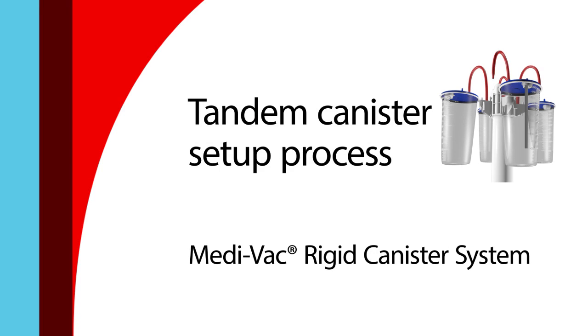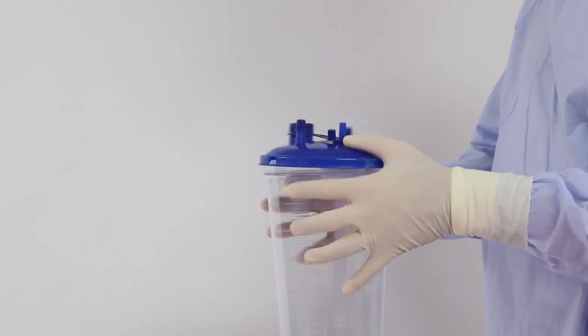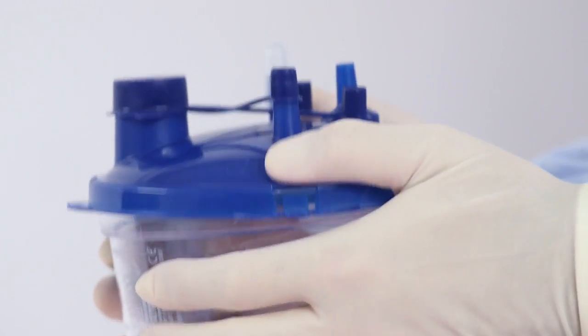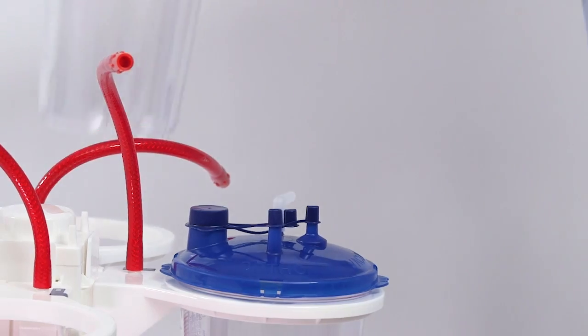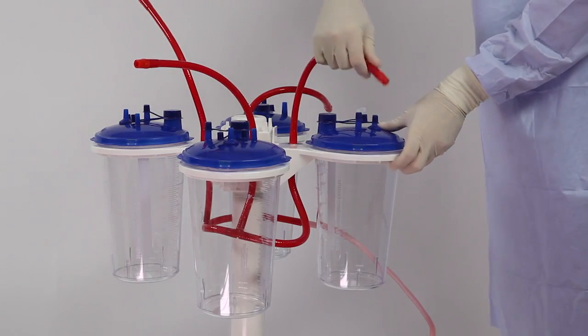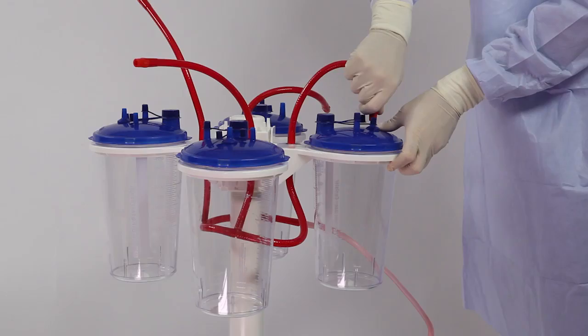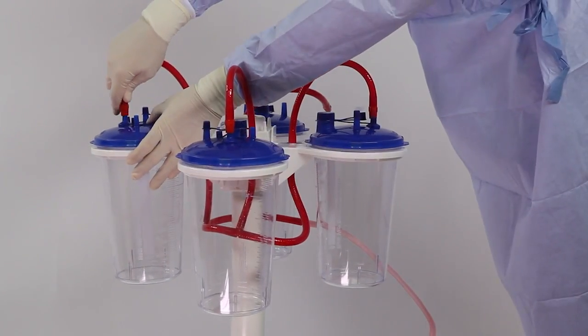To begin the rigid canister tandem setup process, attach lids to all rigid canisters until all tabs have clicked. Insert rigid canisters into corresponding ring brackets. On each canister, connect the red braided tube to the vacuum port using a push and twist motion. Ensure a tight seal.